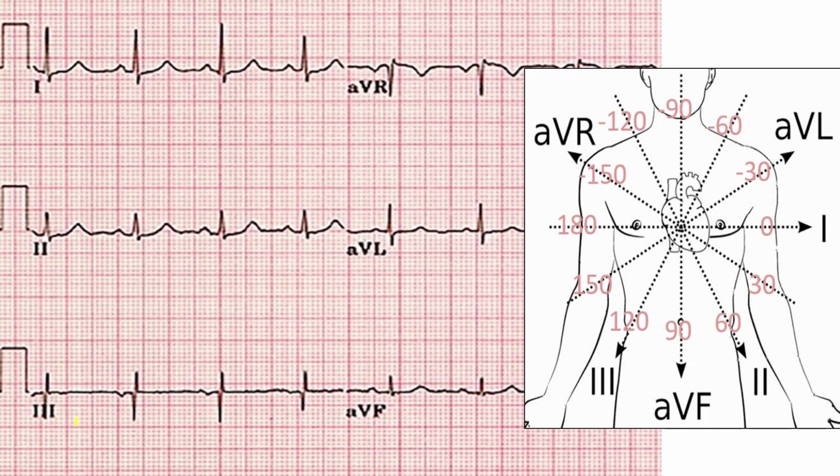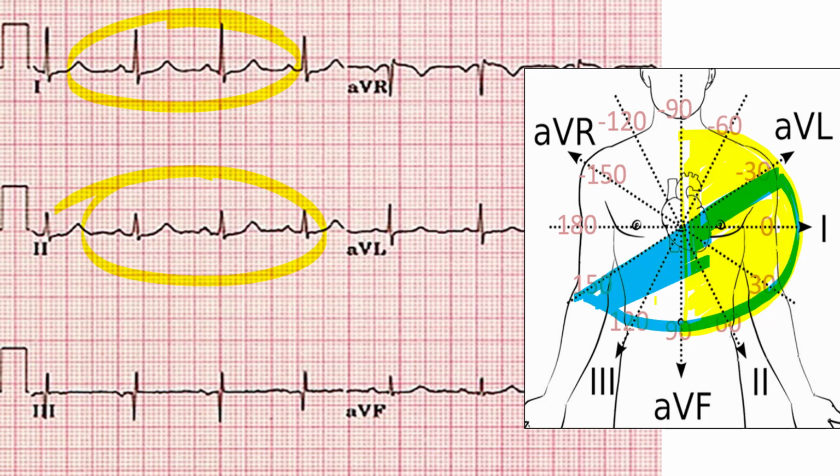But I wanted to show you on a real example where you don't know what their axis is. So again, the first thing you should do when you're presented with an ECG and you want to find the axis is try to find the highest peaks. Try to find the most positive QRS leads. And in this case, it's pretty clear lead 1 is the best response. So we're probably going towards the left side. But we also want to look at lead 2. Lead 2 is really strong.